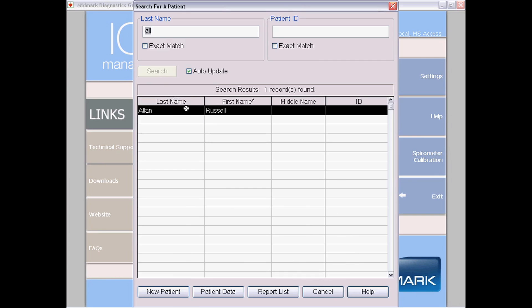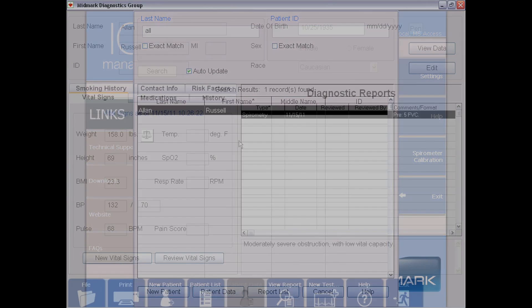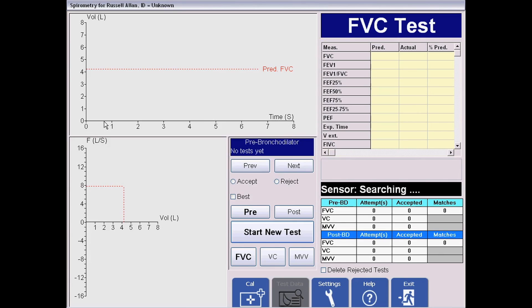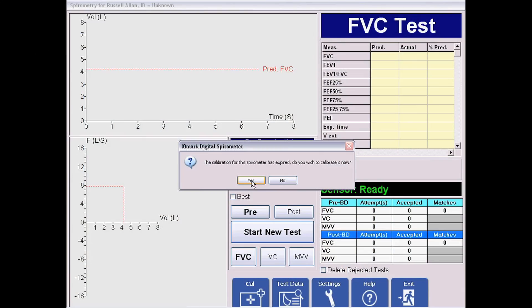You're going to go into the Midmark software and select a patient — any patient. Hit New Test and hit OK. This message always pops up every 24 hours automatically. It says it's been 24 hours since you've calibrated — would you like to calibrate now? Say yes.